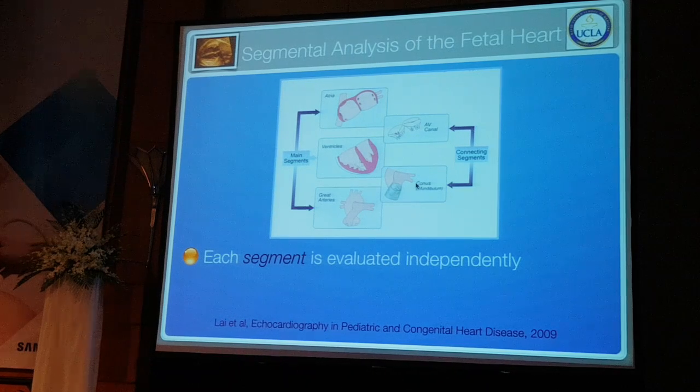When I'm seeing a fetal heart that's very complicated, I like to just zoom in my mind and focus on one part of the heart at a time. Then once you figure out each part, you put it all together. That's the basis of the segmental approach: looking at each part and then putting it all together.